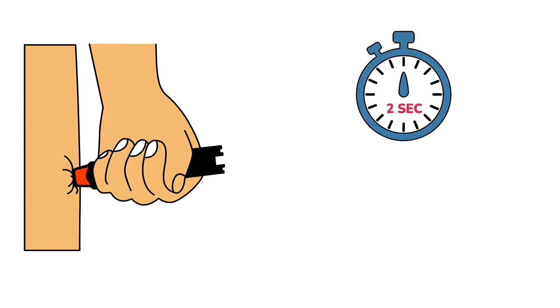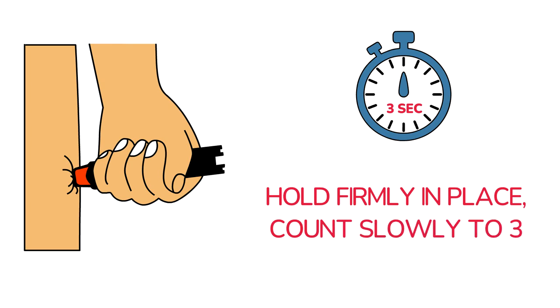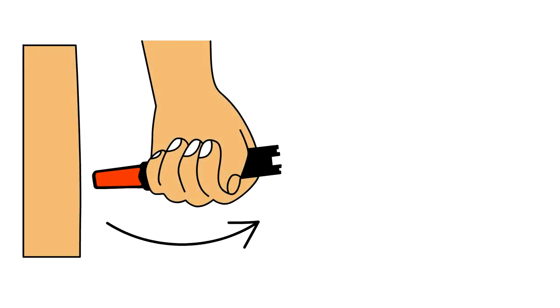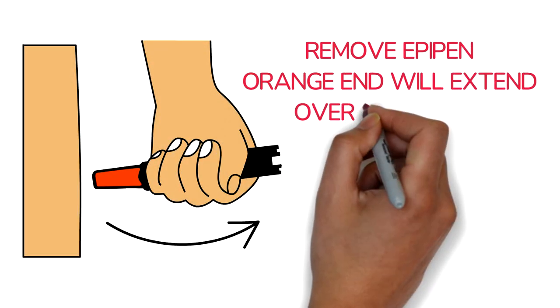Hold firmly in place while counting to three. When you remove the EpiPen, the orange end will extend over the needle.